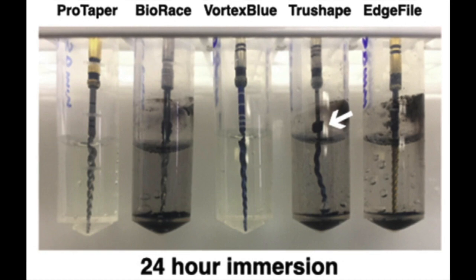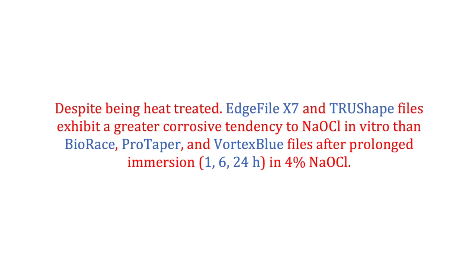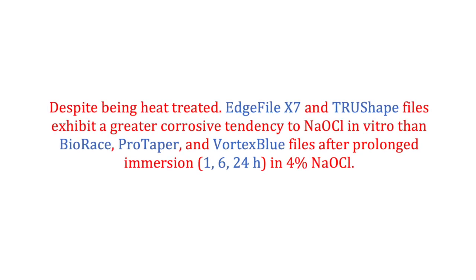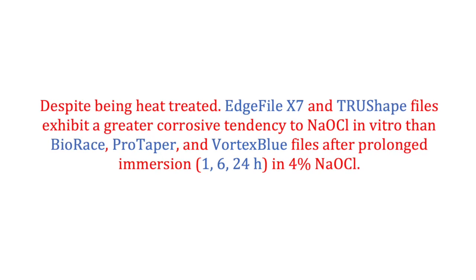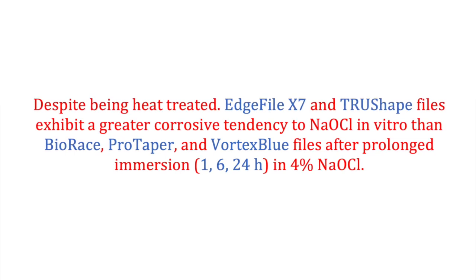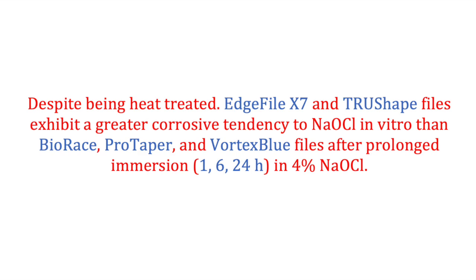We can conclude from this study that heat treatment did not increase the corrosion resistance of the file, and that Edge File X7 and the TrueShape file exhibit a greater corrosion tendency to sodium hypochlorite in vitro than BioRace, ProTaper, and Vortex Blue files after prolonged immersion in 4% sodium hypochlorite.